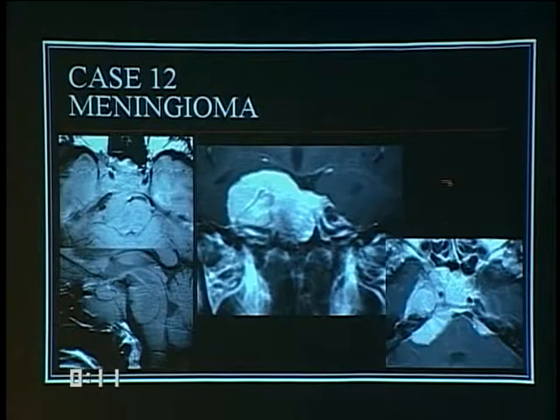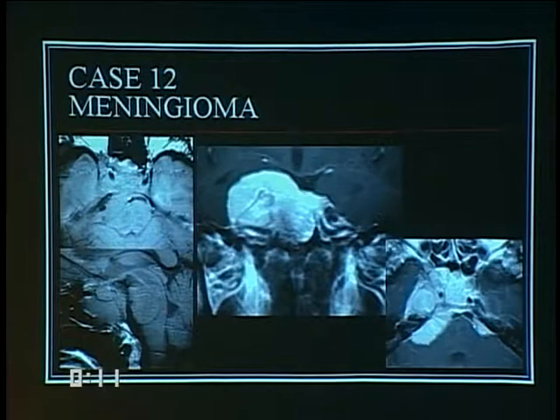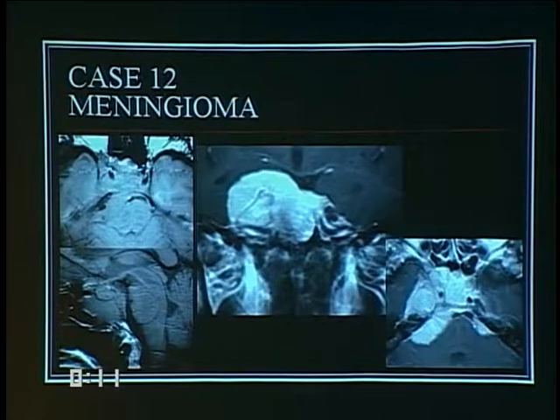Yet another part of that SATCHMO differential, and this abnormal enhancing signal and big mass, again, pushing the brain up. This is meningioma.